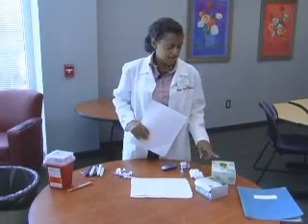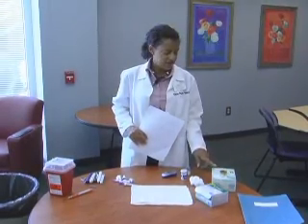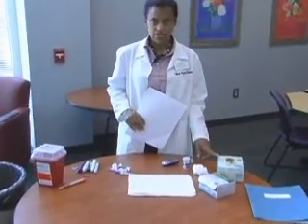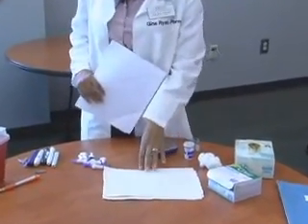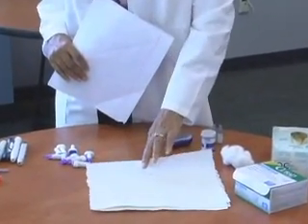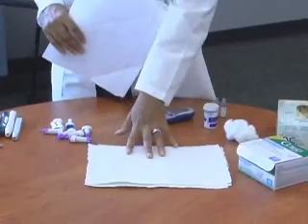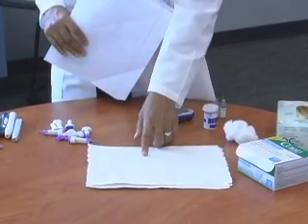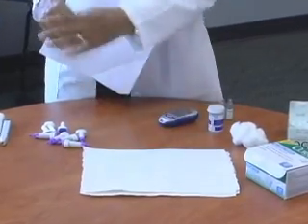Alcohol swabs, gloves — they can either be latex or vinyl. Make sure that they're the correct size for you; if you have large hands, make sure that you have large gloves. Cotton balls. You'll need some type of paper towels or other paper to have down as your work surface, so that in case you get spilled blood, you'll spill it on one of these paper towels that you can throw away.